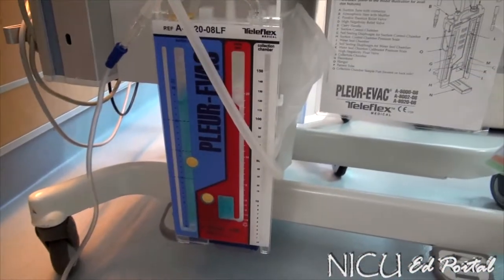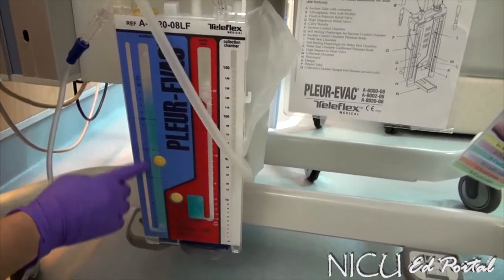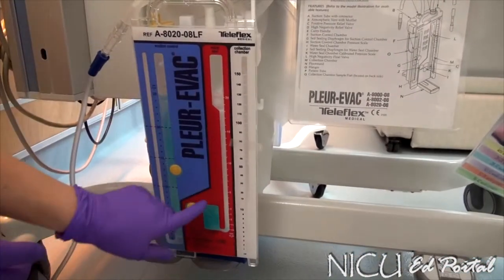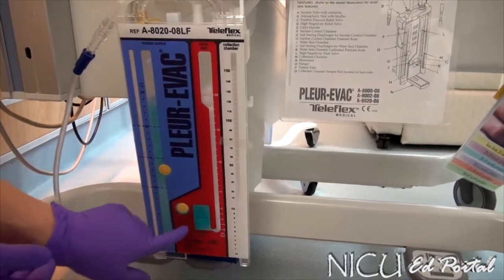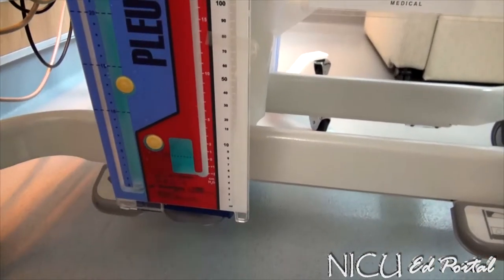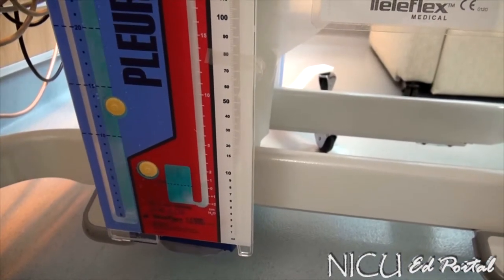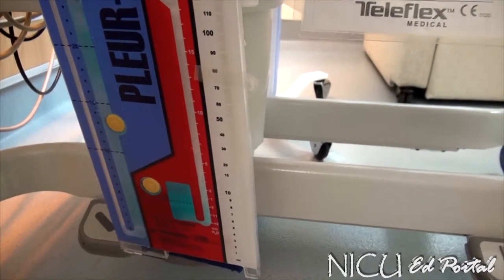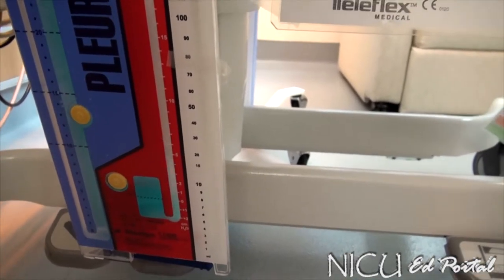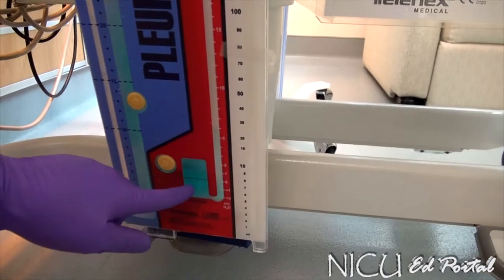Now that we've connected the drainage system, we're going to turn on the wall suction. The suction amount on the wall is not what controls suction — it's the centimeters of water you've filled in, as ordered by the provider. What you can see is a nice rolling bubble in the suction control chamber; that should always have a constant rolling bubble. We also have a very present pneumothorax because air is bubbling and being evacuated.